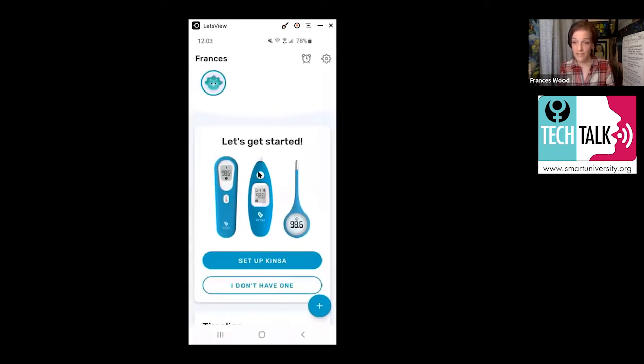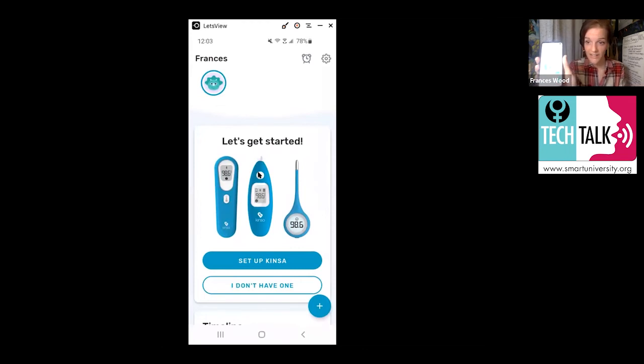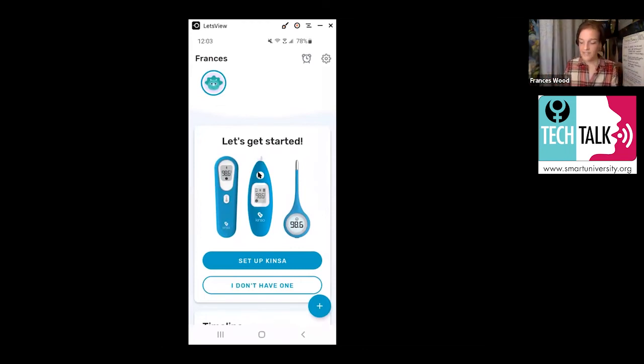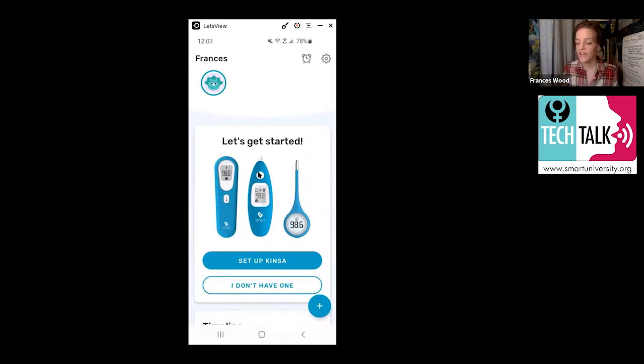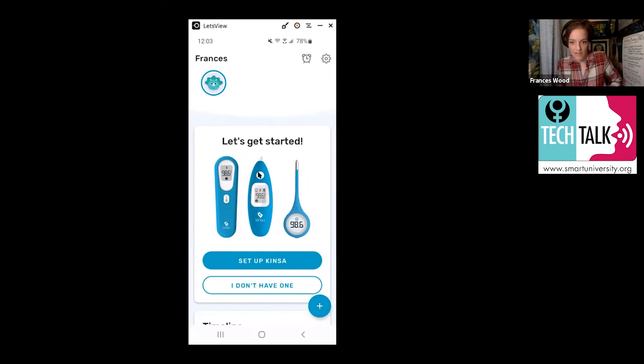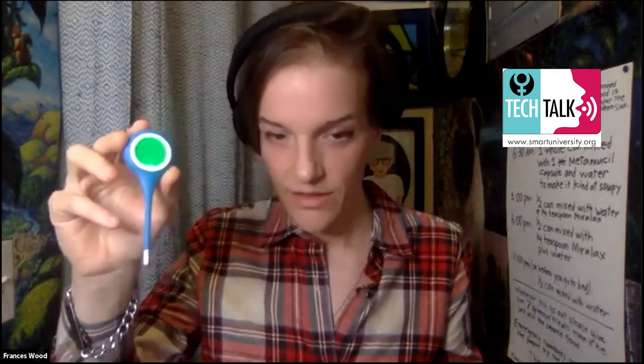That means you are at the critical step of setting up your actual thermometer. I'll show you what the thermometer looks like. You see there's three different varieties of them on there. So this is the thermometer. Looks pretty normal, right? You turn it on and it's linked to the Bluetooth on your phone.